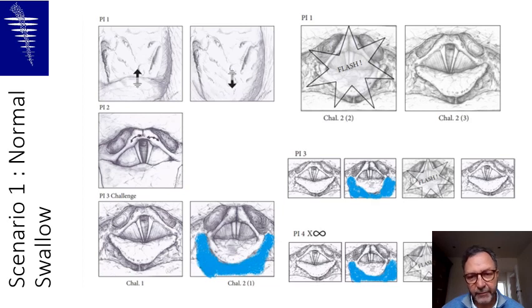You will not see anything, in fact, but just after that, you will have a completely cleared pharynx, no penetration, no sign of stasis during the swallowing. And then you will repeat that sequentially, and you will notice exactly the same sequence with absolutely no stasis at the end. And you will repeat several times the same swallowing to make sure that you're not missing anything. And this is basically the definition of a normal swallow.